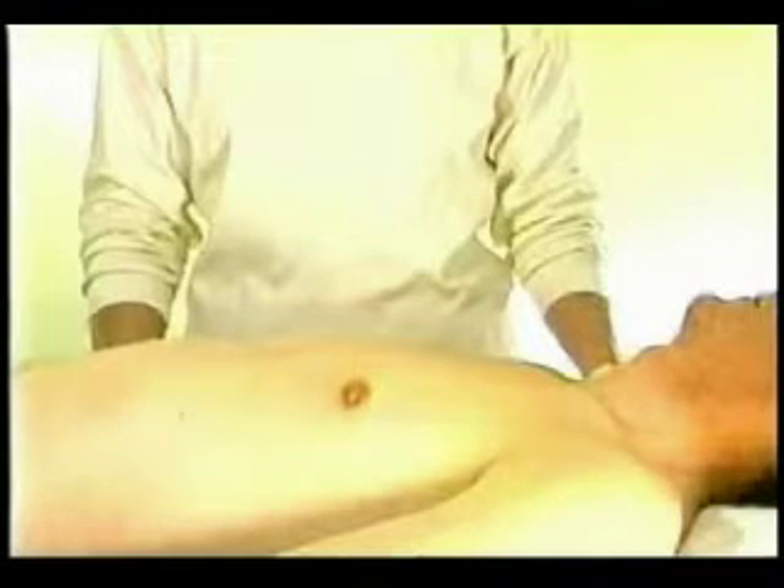Now, let's move on and do a thin needle aspiration biopsy on an actual patient.